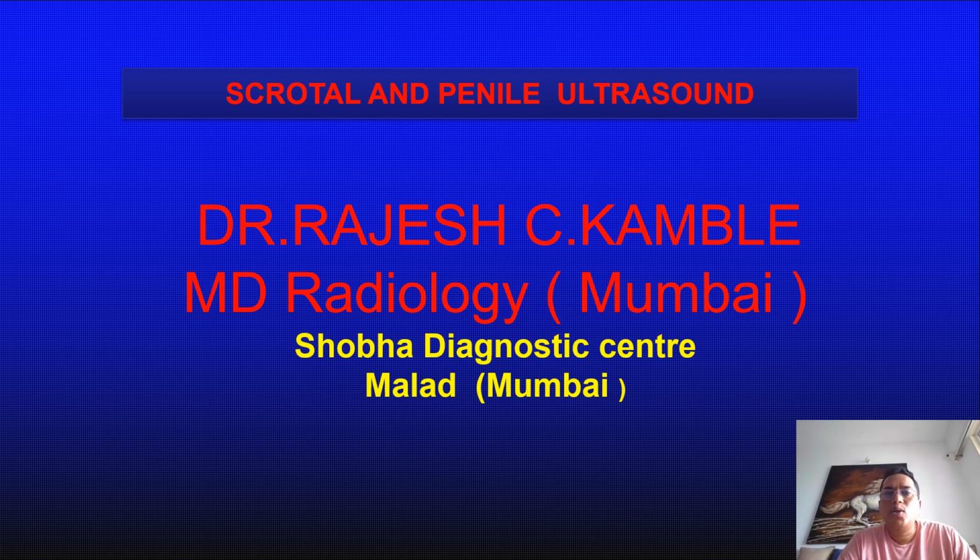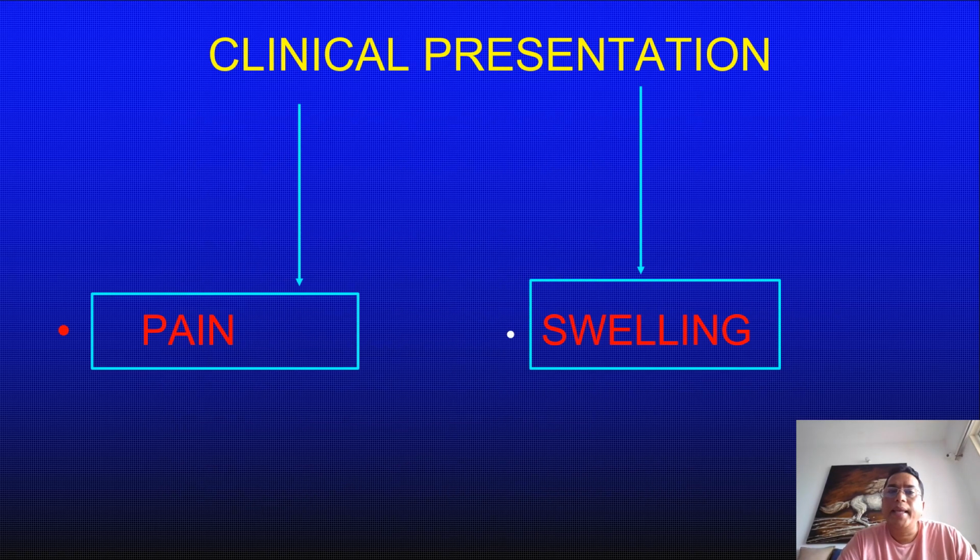We are going to discuss today about the scrotum and the penis. Sono. Basically, in practice, any patient who's going to walk into your clinic is going to have two main clinical presentations. Either he's going to have some kind of pain in the scrotum or a swelling in the scrotum.